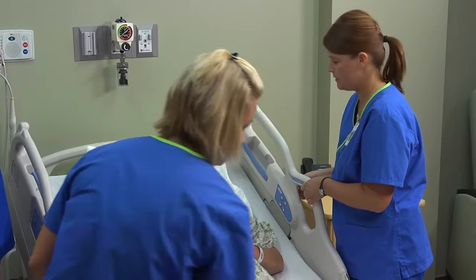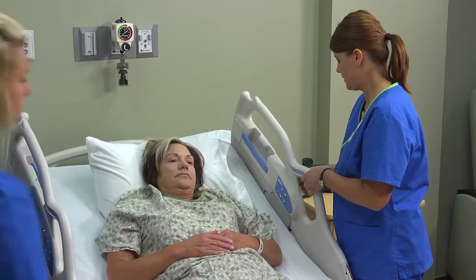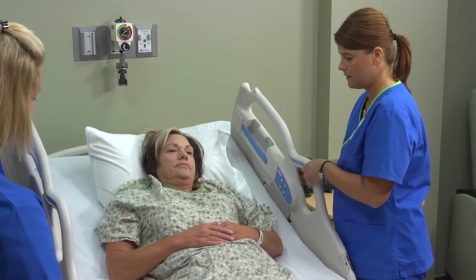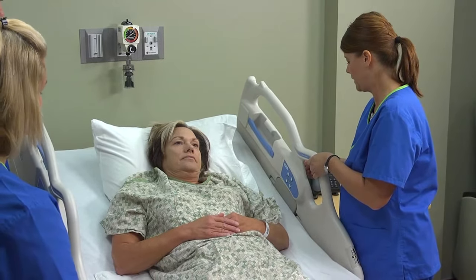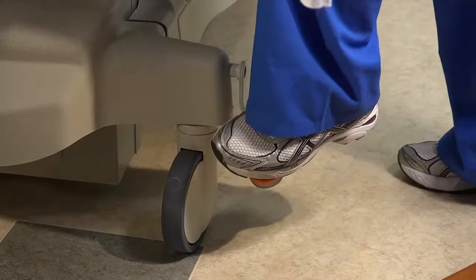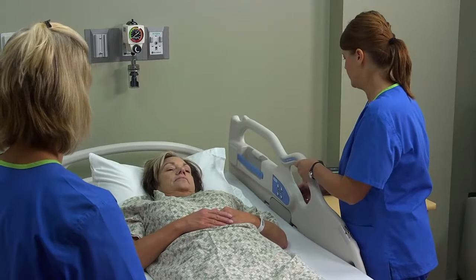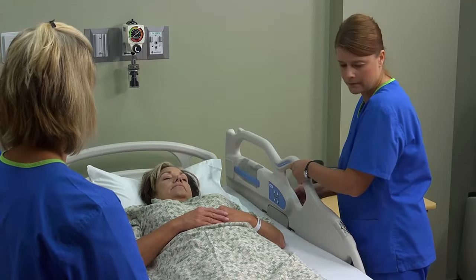Raise the bed and position two assistants on the side of the bed to which the patient will be turned, while you remain on the other side. Make sure the bed brakes are locked. Lower the head of the bed as much as the patient can tolerate.